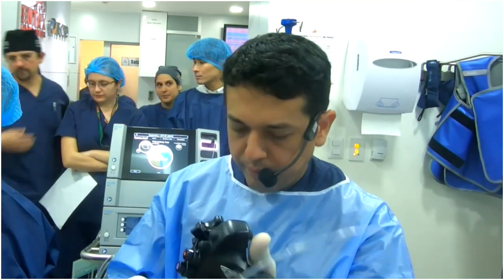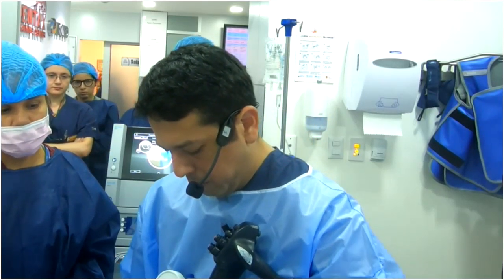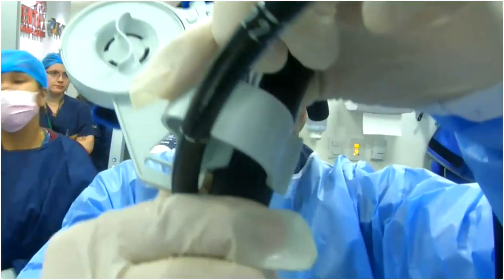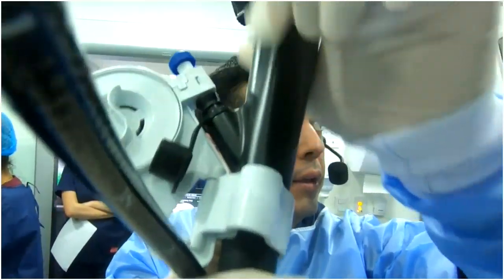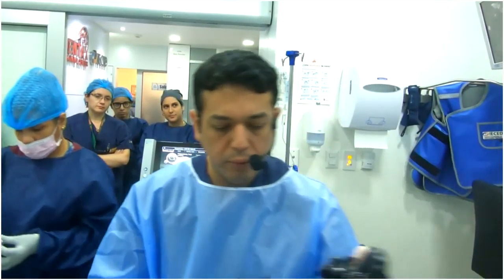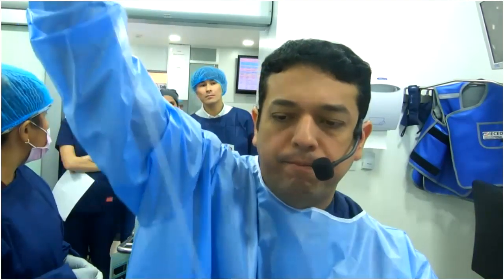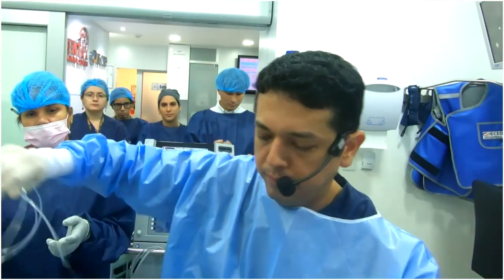We are here. So now we just put it like that, and now it's ready. Once we have that, we proceed to remove this plastic, not before.